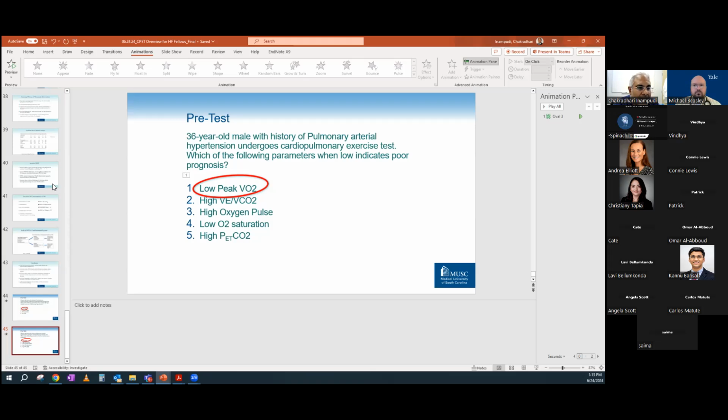So it's another test that corroborates the evidence that despite a low LV function, their exercise performance is really very good. So they have, by descriptive terms, their METs is more than 4, but this also adds an incremental data to us. And in some situations I've also done right heart catheterizations for these patients.